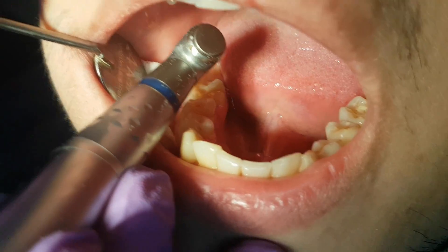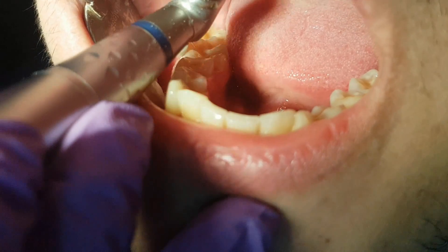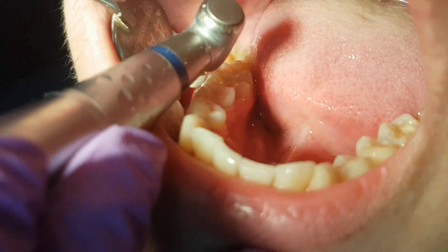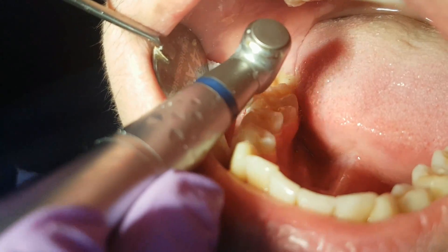When we are done, we go on with the last phase: polishing the tooth. We do this so we don't have retention of dental plaque on the filling and on the tooth structure.